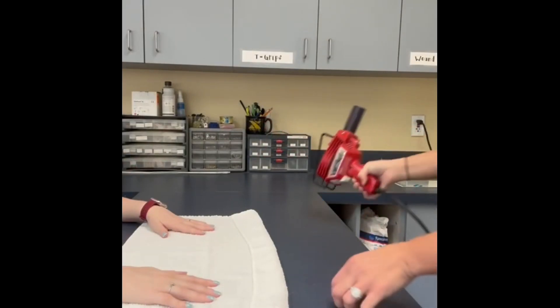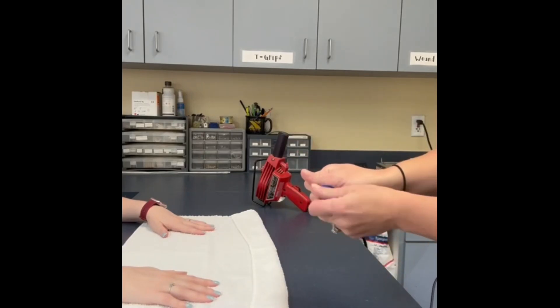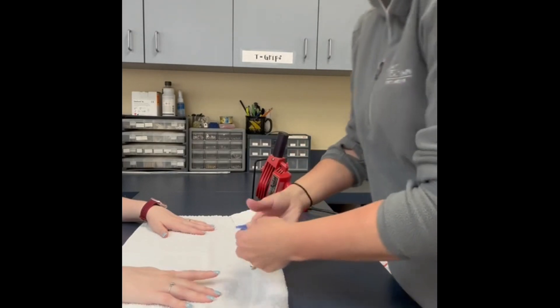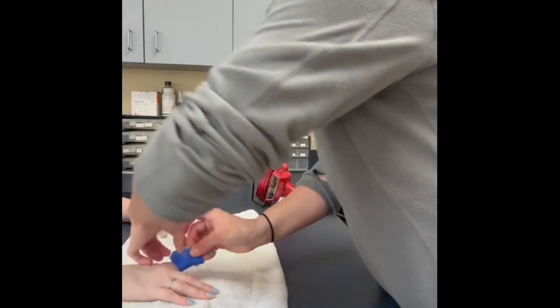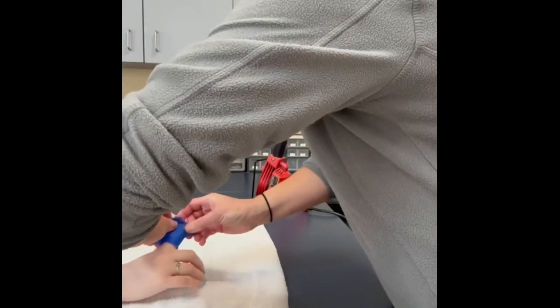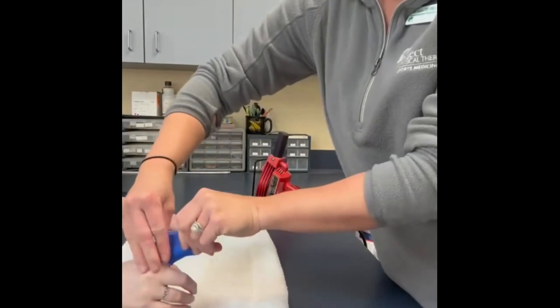Once you have created your double layer, adhering the material together, reheat one more time, stretch the material, and place the Orphocast along the volar aspect of the involved finger, working dorsally and circumferentially around the patient's finger. The DIPJ should be clear for isolated flexion exercises, which will be discussed later in this video.